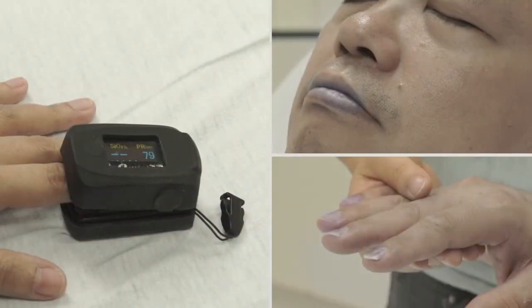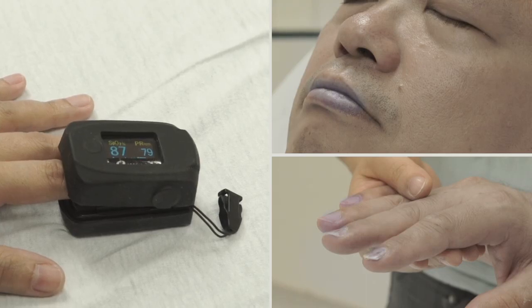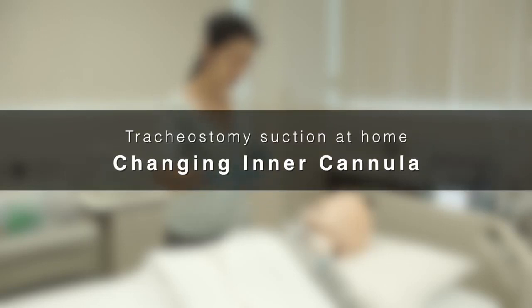Monitor SpO2 levels and heart rate during suction. Stop suctioning if vital signs are unstable. Change the inner cannula after suctioning, as secretion accumulates on the wall of the inner cannula.